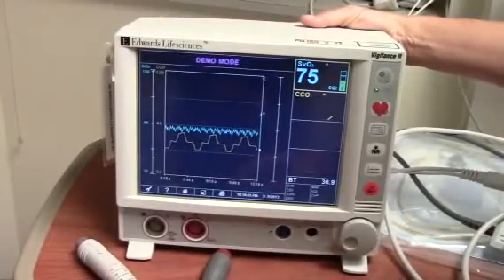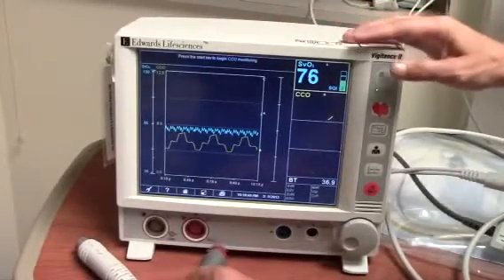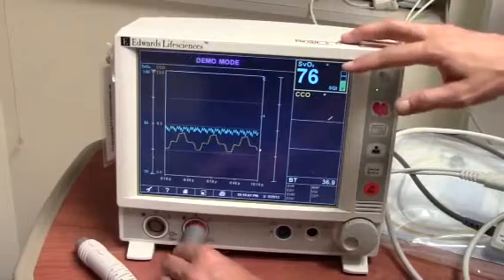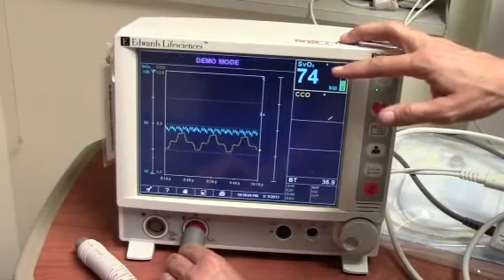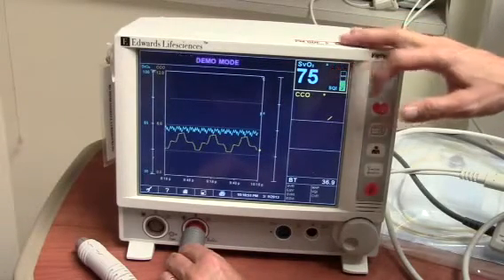Let's review. The optical module cable, red, shows SVO2 data collected.